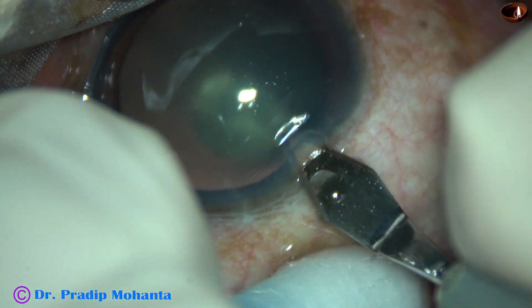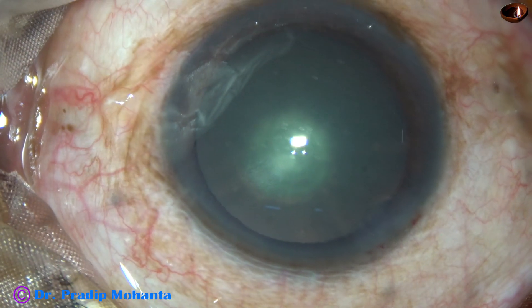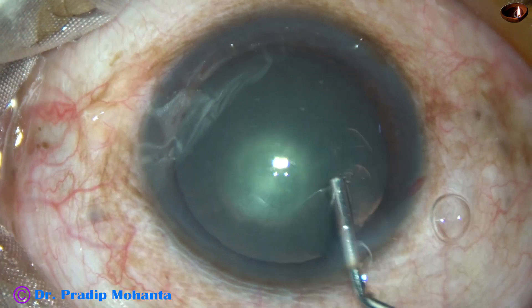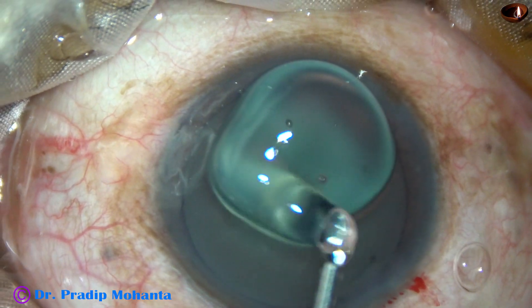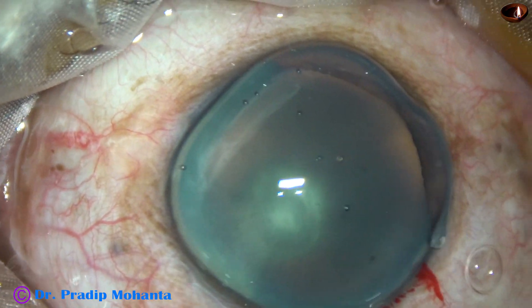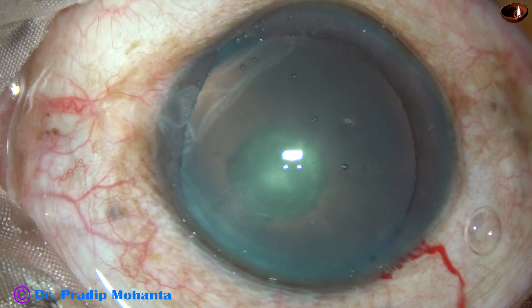This is the main incision with a 2.8 mm keratome at mid-limbus. Now, 2% HPMC is injected into the anterior chamber and applied over the cornea for better visibility and for protection of the corneal epithelium.